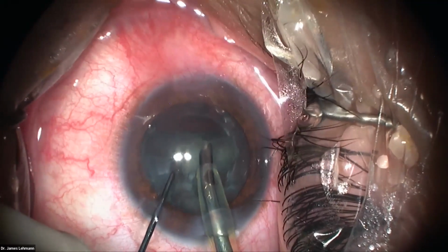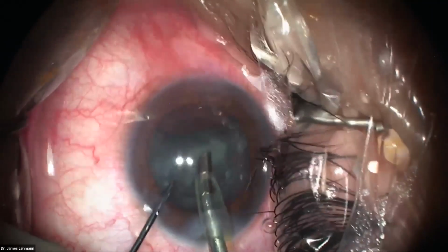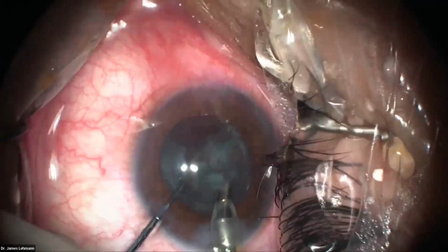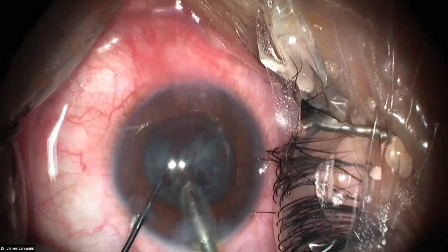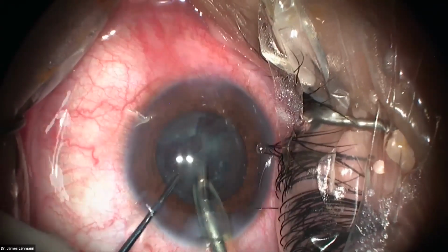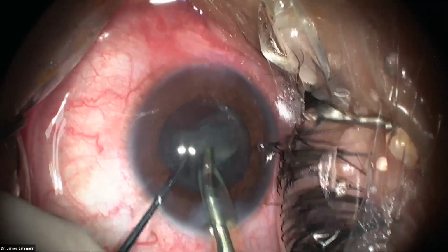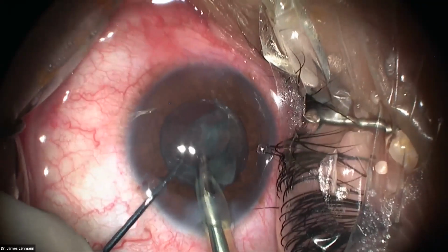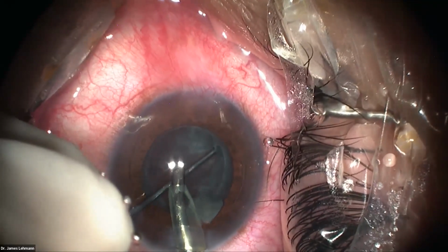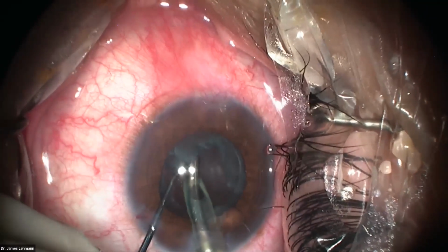Bury the tip. Now I'm not sucking anymore. I'm pulling it up. Now it's freed up in the iris plane here. I'm removing that piece. And then I don't go grab it here. Remember, I'm going to rotate it around. Look at that. Now I'm going to grab it because it's safer. Okay, then I'm going to come back. I'm not trying to grab it over there. I'm rotating it around. And then I'll grab it.